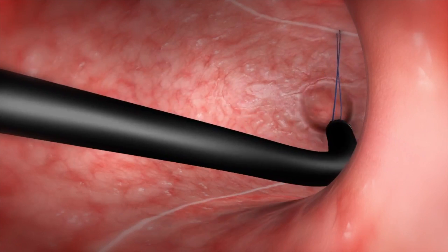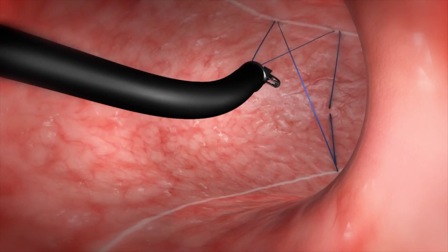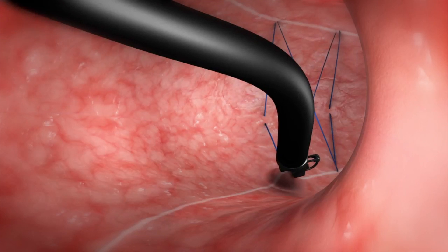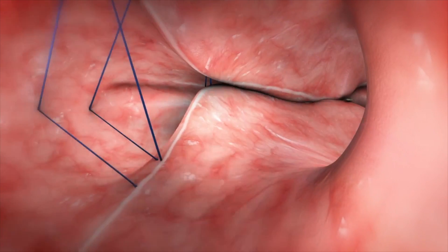We start by suturing the anterior wall, the greater curvature, and the posterior wall of the stomach, and we repeat the suturing in a triangular pattern in a way that allows us to pull these sutures together. When we do that, the stomach gets invaginated on itself, and when we repeat these sutures and pull them together, we form the sleeve.